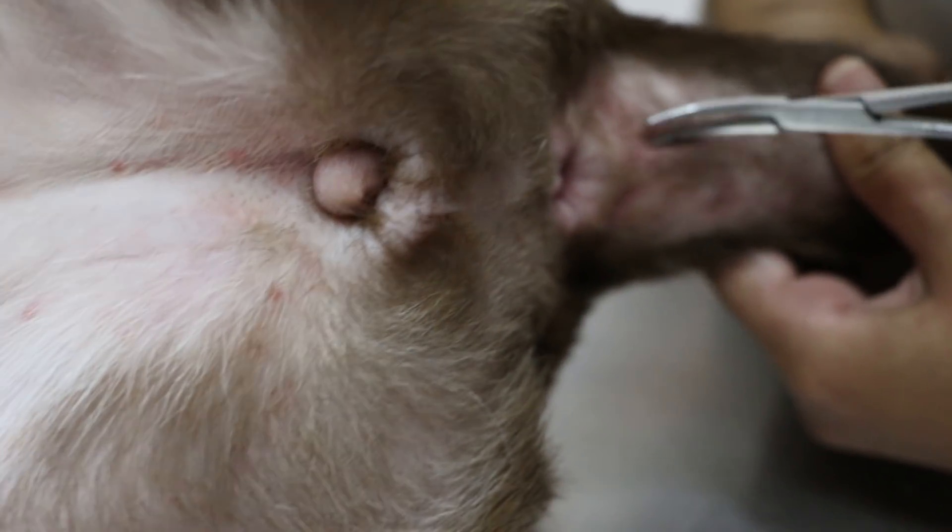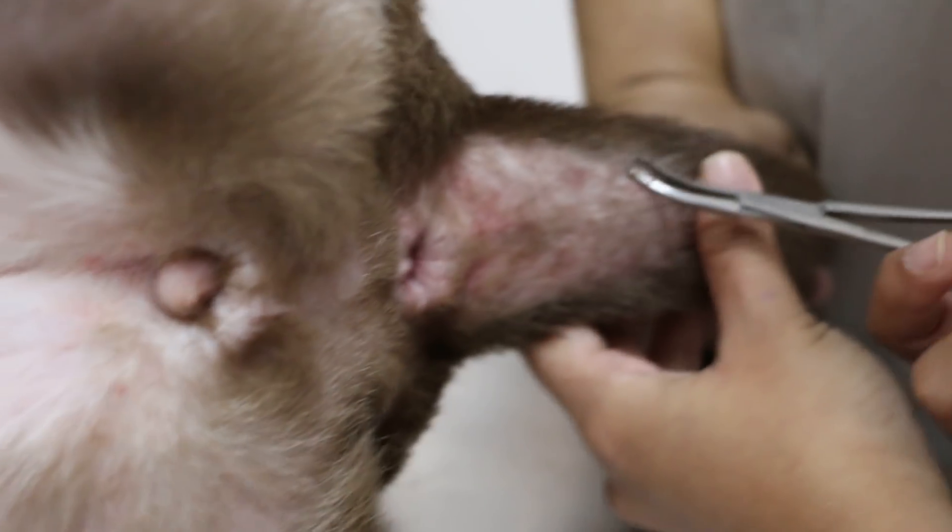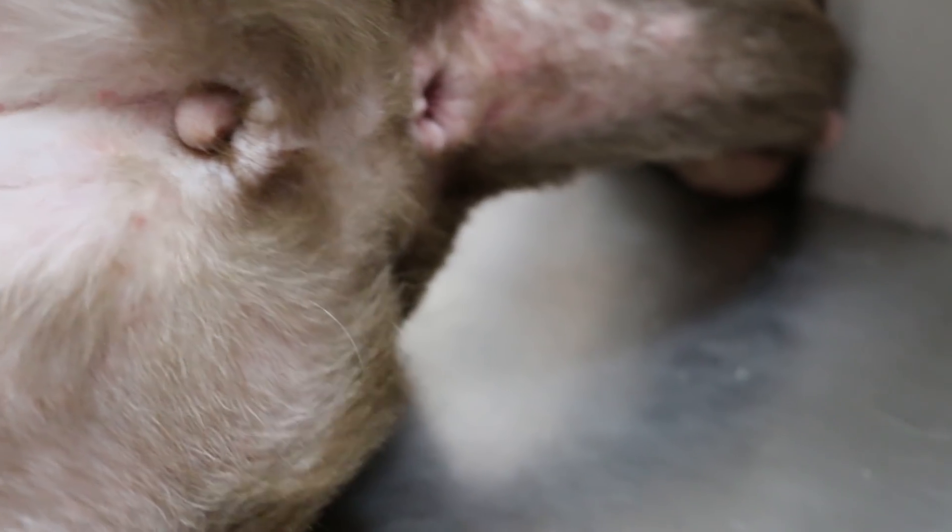Now we take the hair and take six parts. One part — not at 12 o'clock center — then another part, not the same area, maybe 1 o'clock or something. These go in tray DTM.